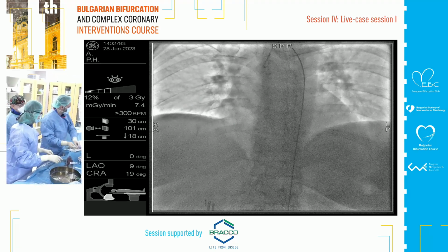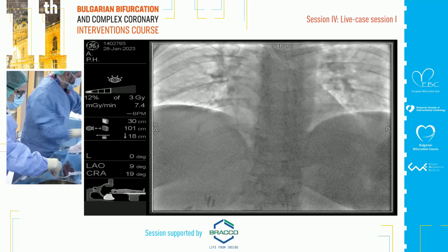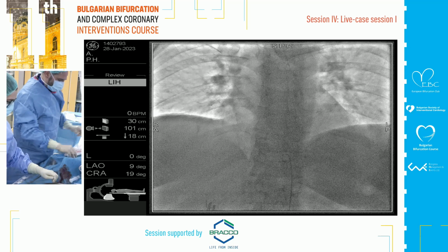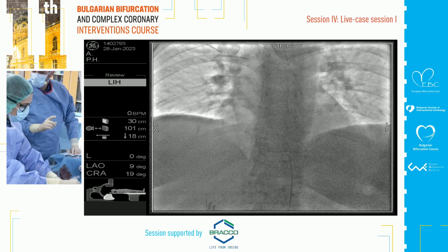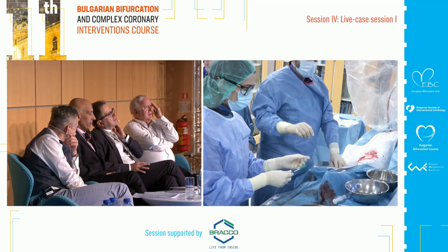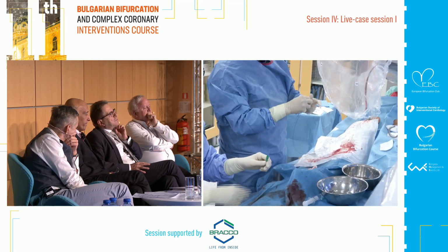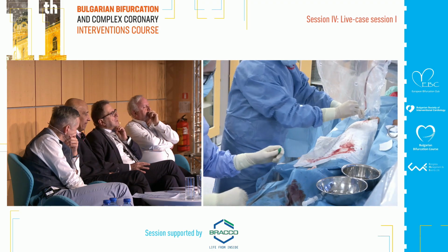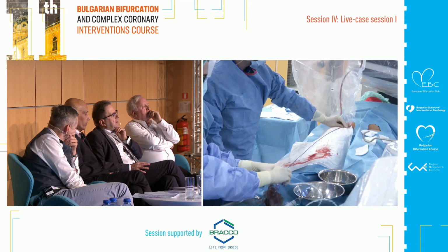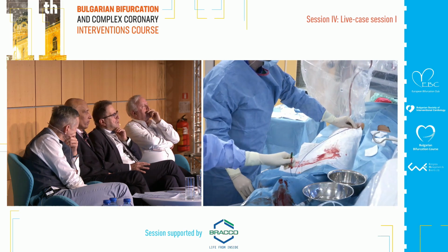But she had a stent in the right a few months ago or last year, right? The RCA stent. What kind of guiding? The lesson of this first stent implantation is that you have to be completely sure that the material to be covered by the stent is very soft. Otherwise, I will always predilate ostial lesions. Always, always, always.